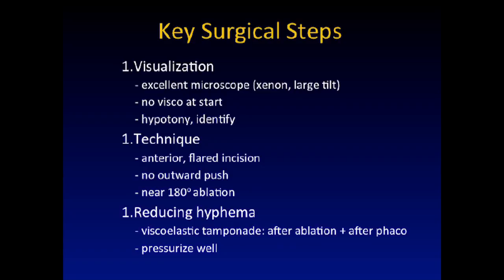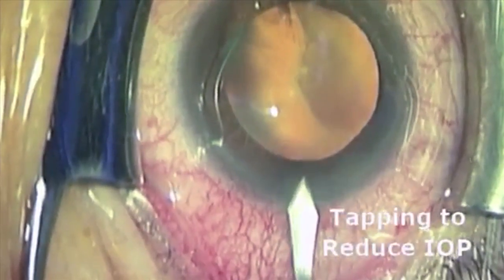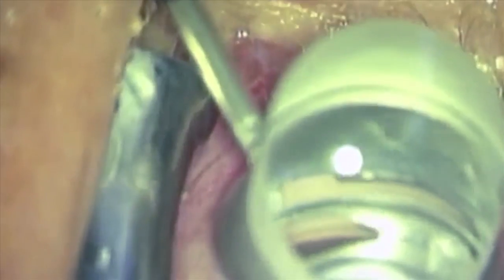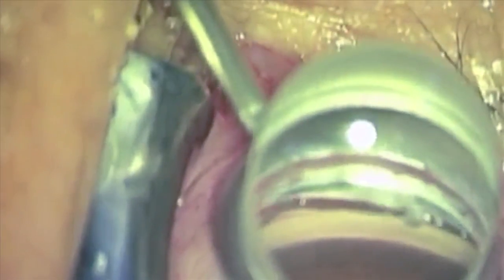The second mistake that beginners make is, of course you want to have a formed chamber, so you, bam, inject a bunch of viscoelastic in the AC. Don't do that. It traps bubbles. Induce low pressure in the eye. You want to see where the meshwork is. You gape the wound, you want to see flow back in the canal. Where you see red, that's where the canal is. Don't go after the ciliary band.